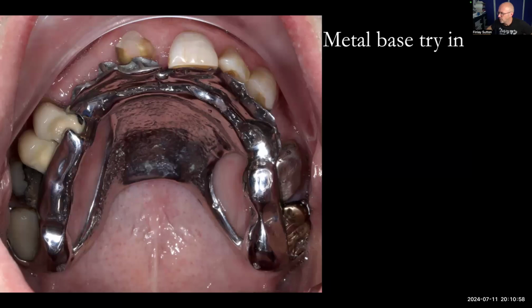Why not cover the whole molar occlusal surface? As in this case, the OVD is also increased. It's a very good question. I don't fully cover them because of aesthetics. If I take it right to the edge there, the patient looks like that. You know the villain out of James Bond called Jaws, who had metal teeth. The patient can effectively look a little bit like that. So bringing the metalwork just in a little bit like that disguises it, and it's quite amazing how that really disguises it. If you look through some of my cases in the case study section, you'll see them looking like this. So that's why I do that. But we still have a bite on that surface. They're not biting on the teeth there at all on the side.